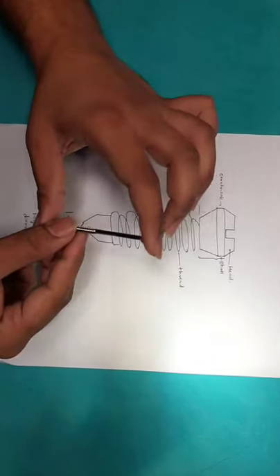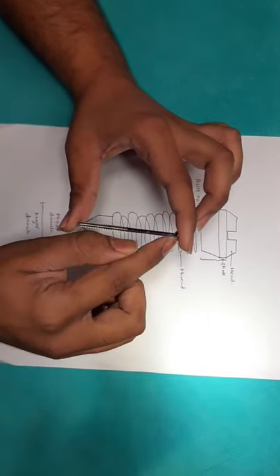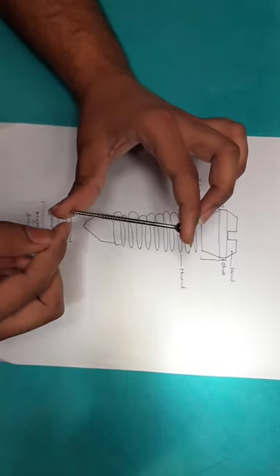Now, anatomy of screw. A screw has four parts: this is the head, this is the shaft, this is the thread, and this is the tip.